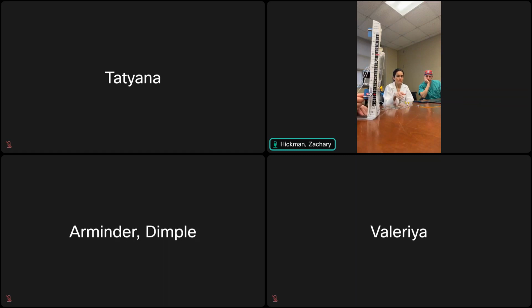Yeah, so we can finish off how to troubleshoot the EVD that isn't working, before zeroing, right? And one of the things that we also have to check is the dressing, right? Because sometimes it may be oozing around the dressing, or maybe the patient went to the scan and it was accidentally pulled out. So always make sure, you don't need to undress the incision or anything, but just make sure that everything is not soaking and everything looks good in the proximal end of the EVD, right?